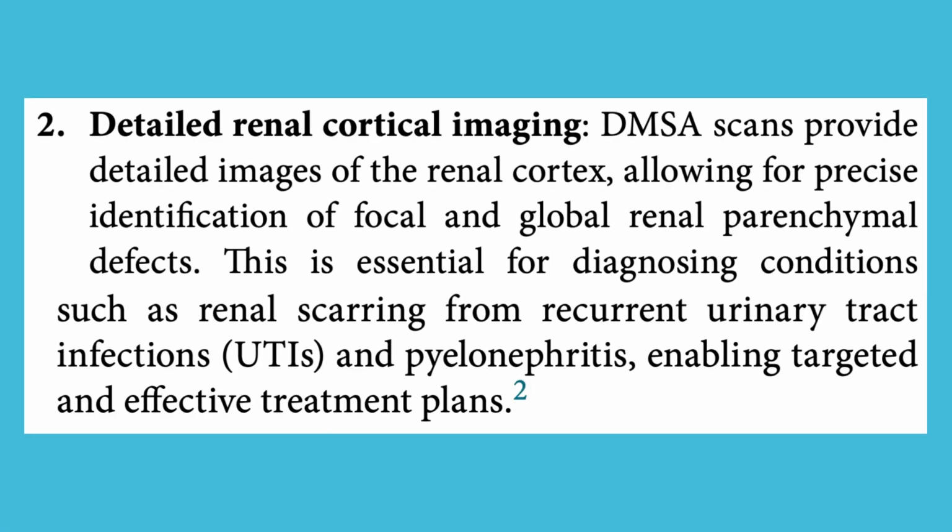2. Detailed renal cortical imaging. DMSA scans provide detailed images of the renal cortex, allowing for precise identification of focal and global renal parenchymal defects. This is essential for diagnosing conditions such as renal scarring from recurrent urinary tract infections, UTIs, and pyelonephritis, enabling targeted and effective treatment plans.